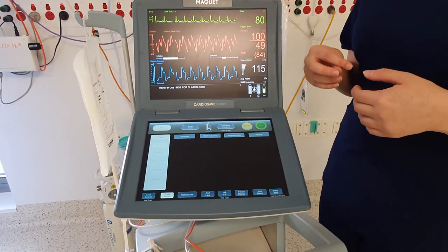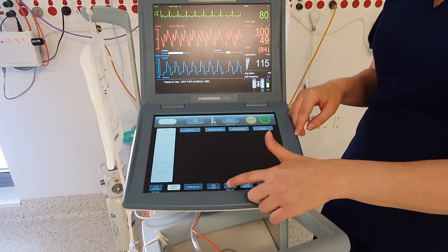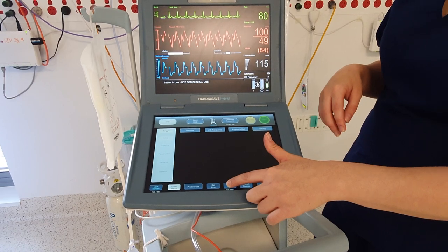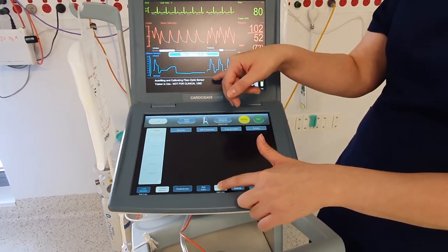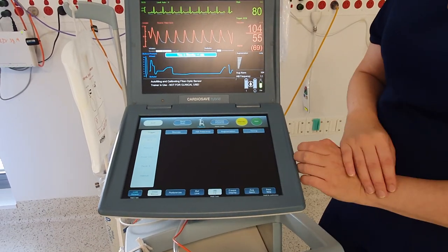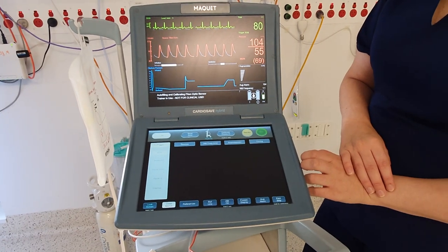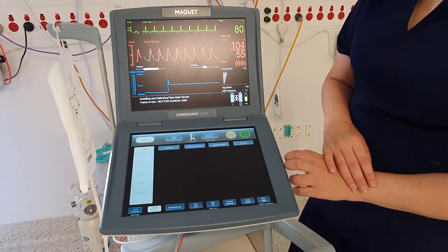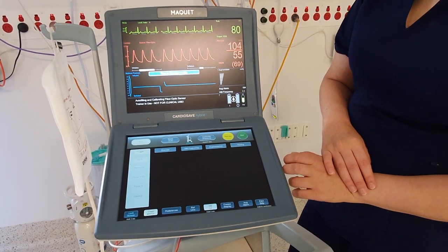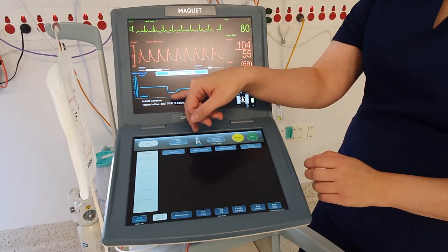So we're going to go through how to do an IABP fill. See this button here? Hold it for two seconds, and it'll say 'auto-filling and calibrating fibre optic sensor.' You'll just have to wait a little bit. Once it's complete, it'll say 'auto-fill complete.'